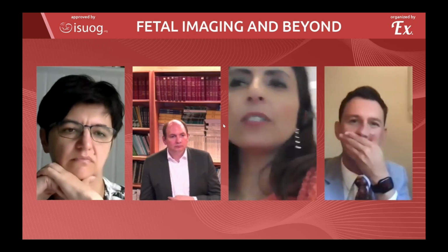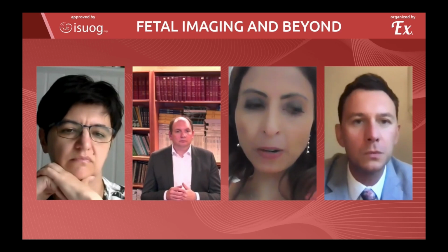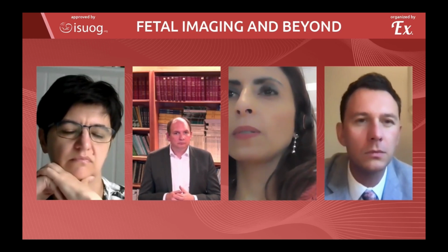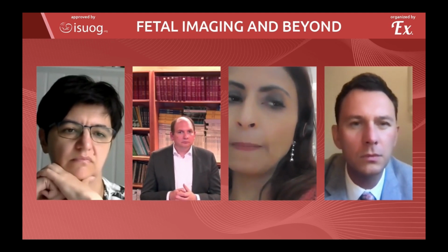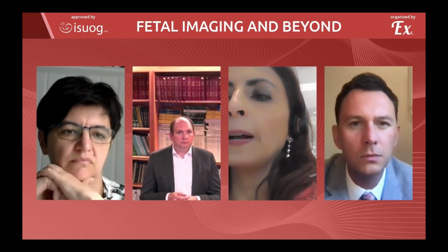I think this is a really good comment, Gregor, and thank you very much, because I really think that probably MRI is more sensitive to intracranial hemorrhage compared to ultrasound. I think certainly we would probably miss particularly minor bleeding in the brain or focal bleeding, while actually the MRI would be more sensitive.